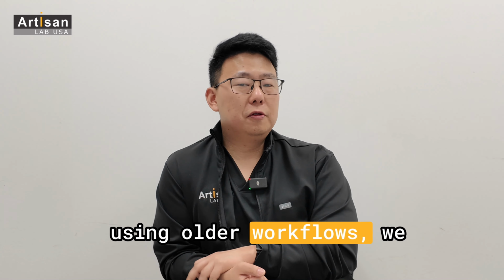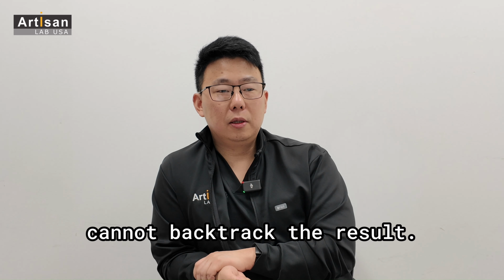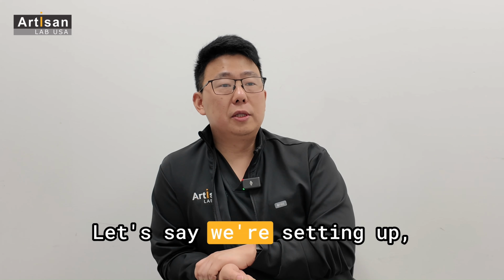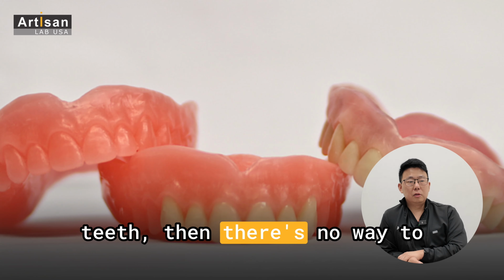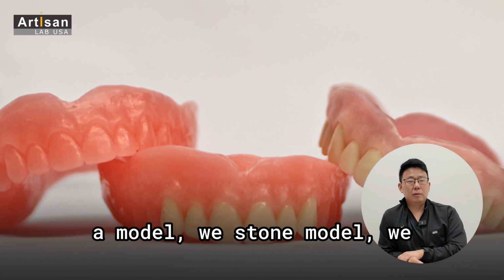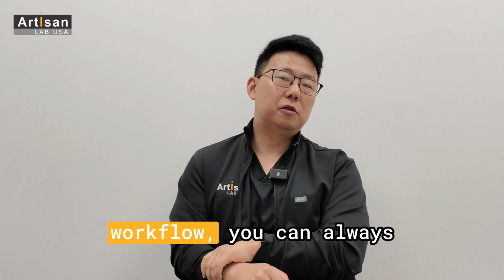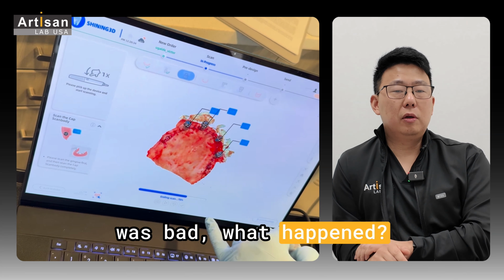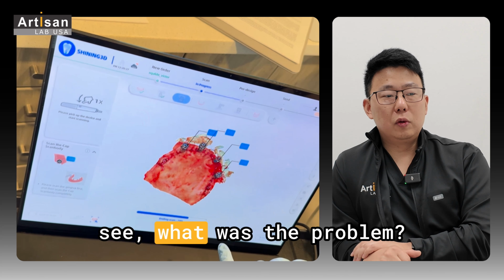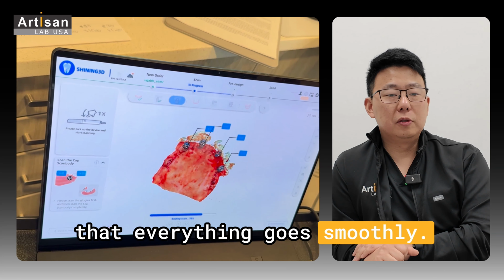Using older workflows, we cannot backtrack the result. Let's say we're setting up the teeth with wax and denture teeth, then there's no way to backtrack it unless we make a stone model, something physical. But with the newer digital workflow, you can always backtrack to see what was bad, what happened, and what the problem was. And we can plan everything before the surgery day so that everything goes smoothly.